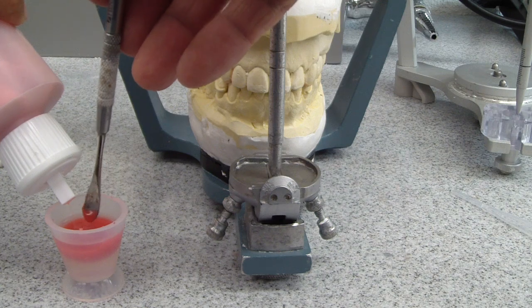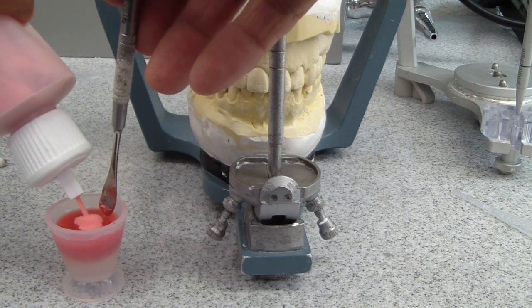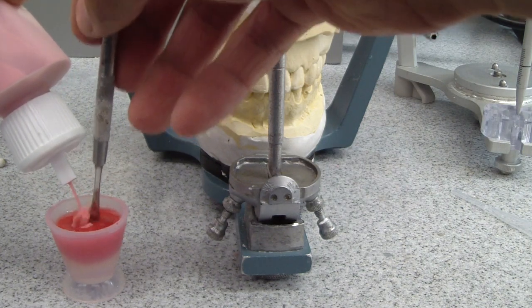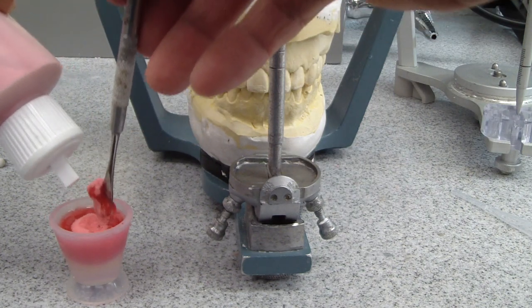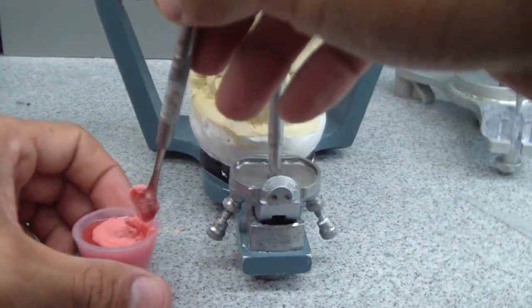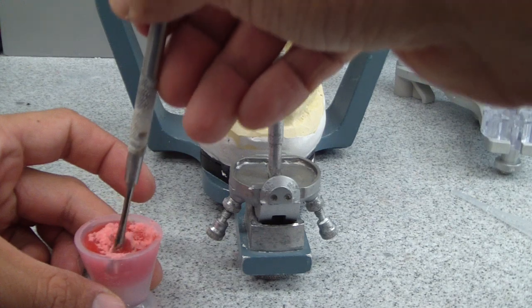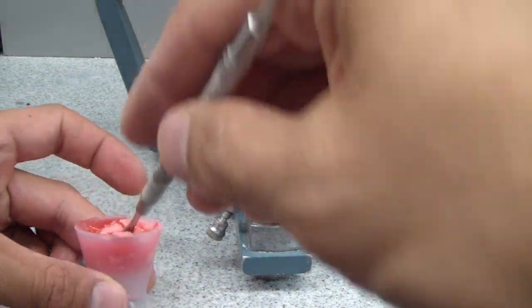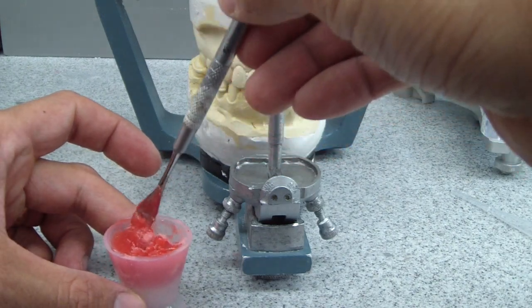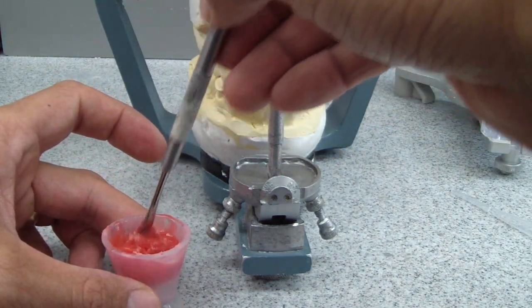We're doing this because we want to ensure that our restorations are fabricated as close to the functioning provisionals that we have intraorally. Lab time is much cheaper than chair-side time in terms of economics, time, and even patient confidence. So if we can get these restorations fabricated to as close to the final perfect result that we want, that makes everyone much happier.